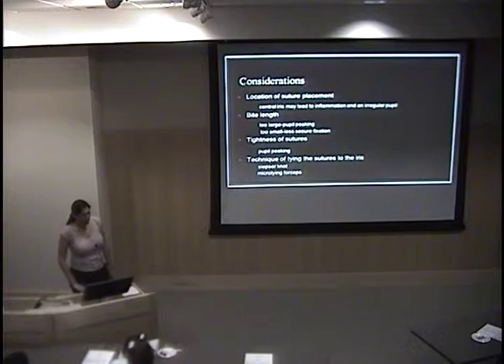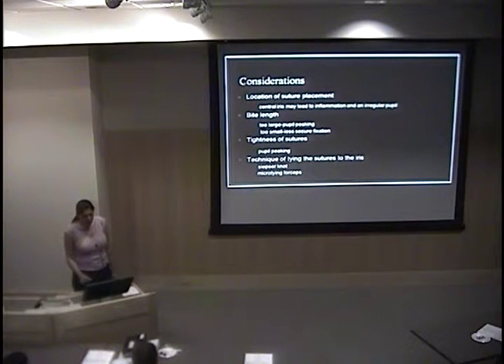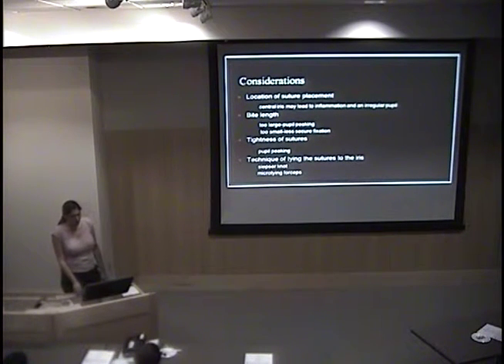So when doing an iris sutured lens, there are certain considerations. You want to make sure you're placing the suture more peripheral to avoid the central iris, which is more mobile, so it can lead to more inflammation and an irregular pupil. You don't want the bite length through the iris to be too large, as that can lead to pupil peaking. If it's too small, it can cheese-wire through the iris and lead to a less secure fixation around the haptic.